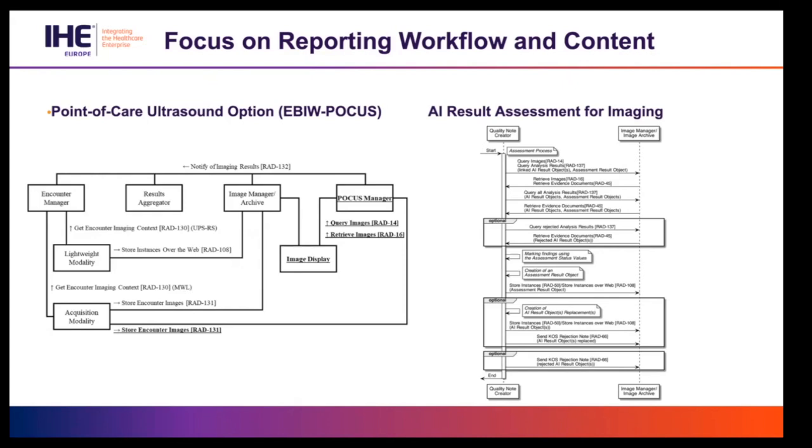The point of care is the last one we want to point out. It is an extension of the enterprise-based imaging workflow profile that crosses the lines a little bit between radiology and enterprise imaging. It allows managing images and reports which are created as part of point-of-care ultrasound procedures.